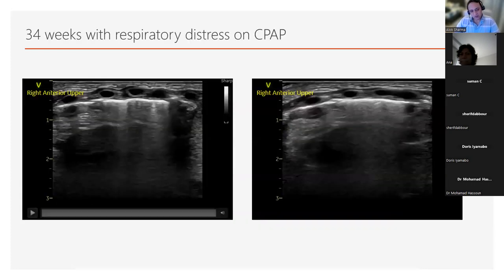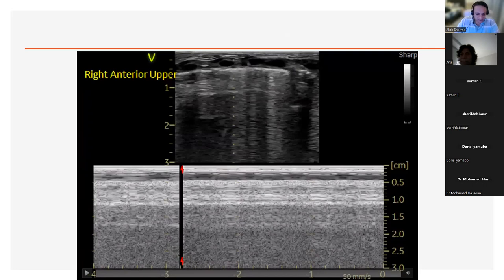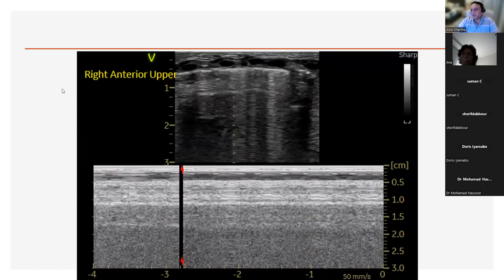Now my question at this particular point is, if I said to you there's a barcode sign over here, I'm just curious, with a show of hands, guys, all of you have to give me an answer. This is a baby in 40% oxygen with a gas like that. So how many of you want to think of a needle thoracentesis at this stage based on this image? And how many of you want to do a chest X-ray? So I want an answer from everybody, please. Chat box.